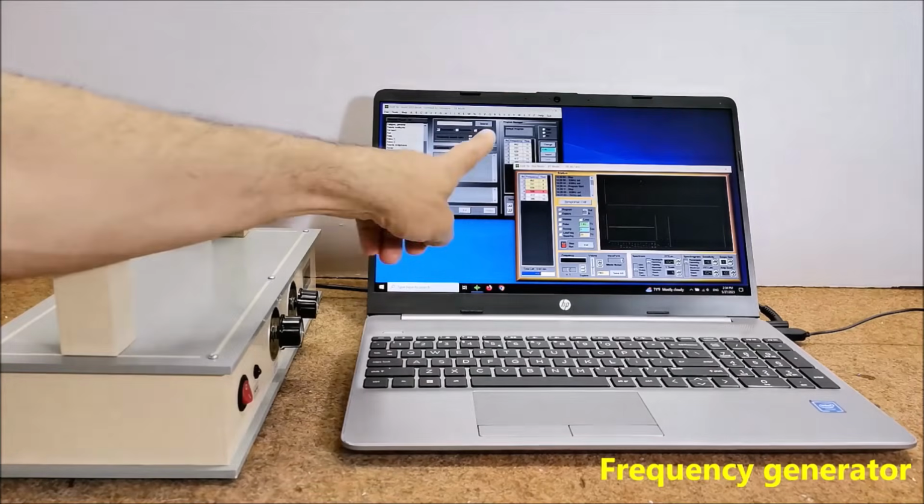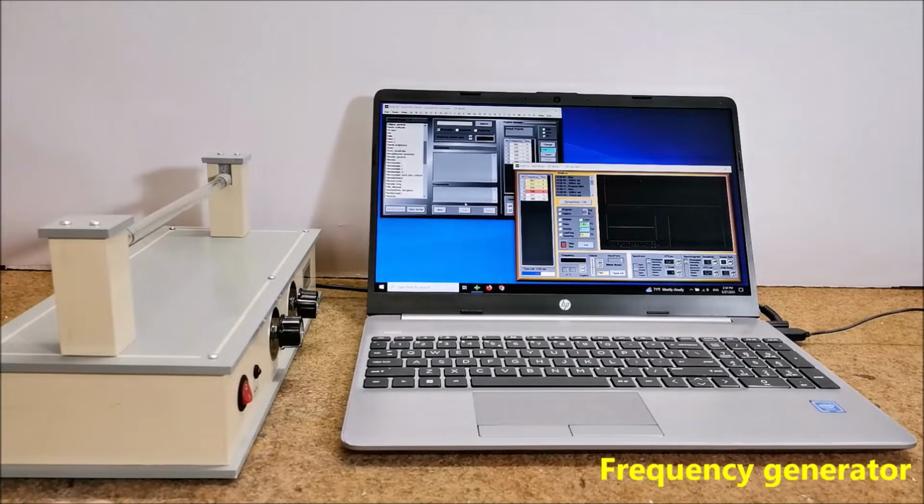The software is Frex16, and you can freely download it at the given address. The application contains a large database with ready-made Rife frequency sequences for various diseases. We can search for the disease according to the initial letter or through the search tab. A very useful function is that we can assign our own frequency sequence, which is not contained in the given database.